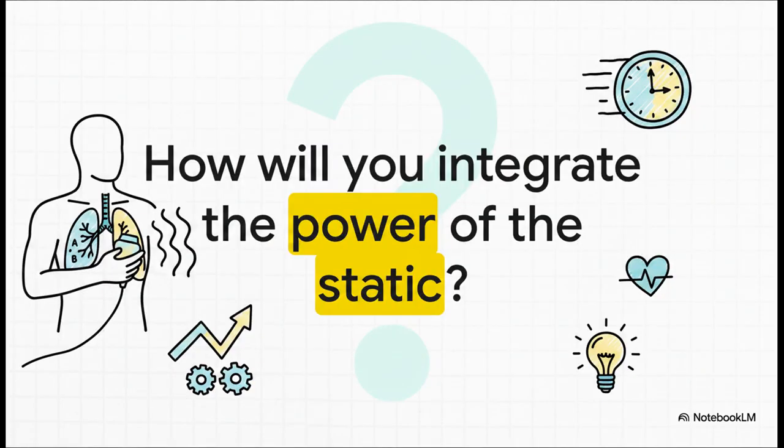Which brings us to our final thought for today. You've got the visual dictionary now. You know the science, the lines, and the staggering accuracy rates that make this tool so absolutely vital. So the real question for all of us is, how will you integrate the power of the static into your own clinical pathways to accelerate diagnoses and save lives?